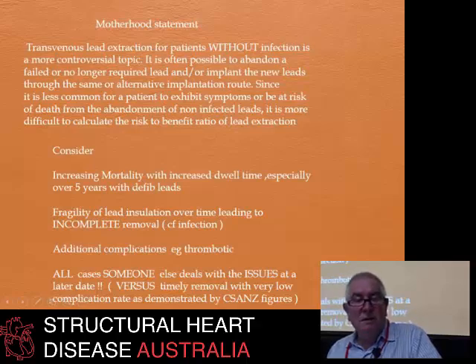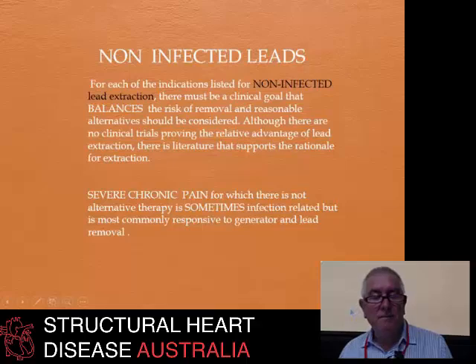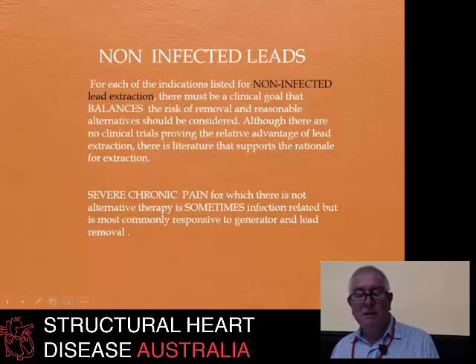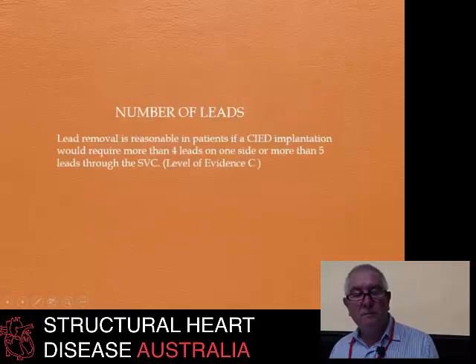So essentially, I think what this statement says is, I'm going to leave it to somebody else and they can deal with it. And I don't know that that's an appropriate way we should be dealing with it, particularly when we look at the low complication rate that we see in Australia. Chronic pain can be an indication where all other causes of pain have been looked at and not considered appropriate.